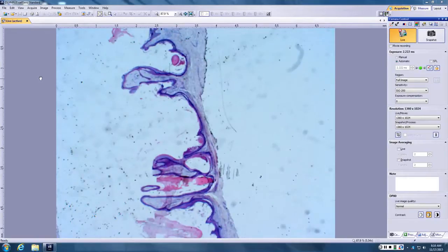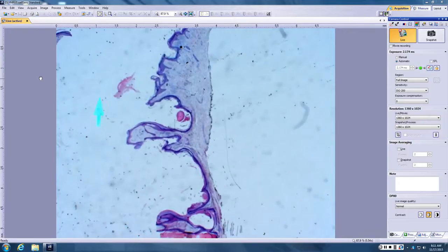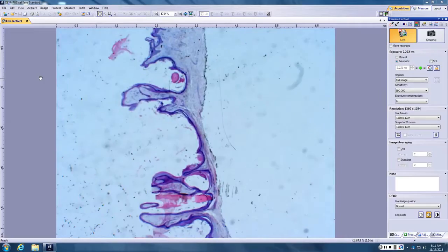One of the things to say about this, it seems like we have this hyperkeratotic lesion where it's all kind of falling apart, falling off. So hyperkeratotic, and the hyperkeratotic part is kind of falling out of it, right? And what's the overall configuration? It's somewhat of like a cup shape, invaginated a little bit. Cup shape, invaginated, scalloped, filled with keratin.